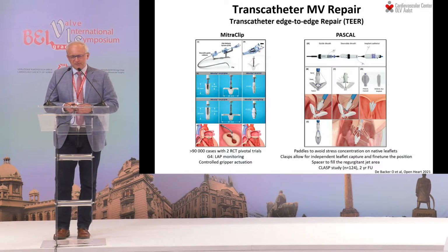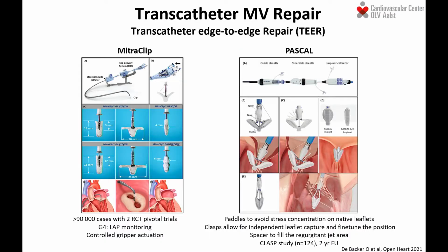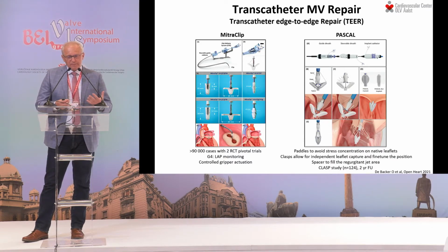Another device that is also addressing the same concept of edge-to-edge repair is the Pascal device from Edwards Lifesciences. The device has 3 components. Basically, there are paddles that are broader than the clip arms in the MitraClip, allowing stress distribution on the native leaflets. There are clasps, which allow very fruitful individual grasping of the leaflets during the procedure. And there's also a spacer that can fill the regurgitant orifice, thereby allowing the use of this device also with huge malcoaptation settings.